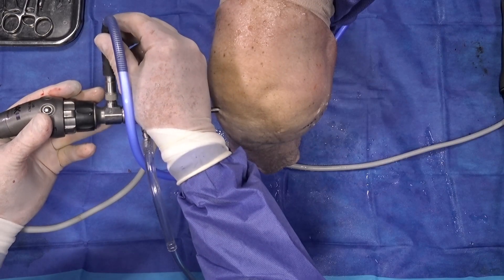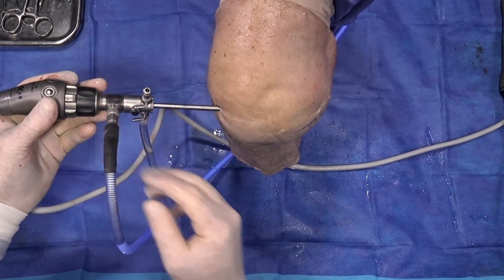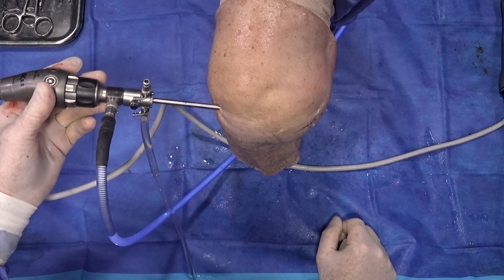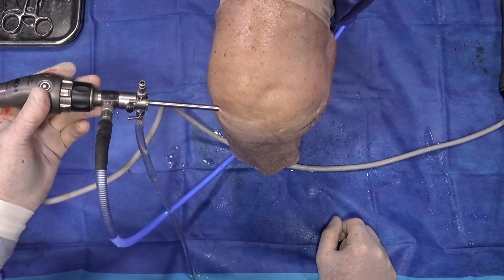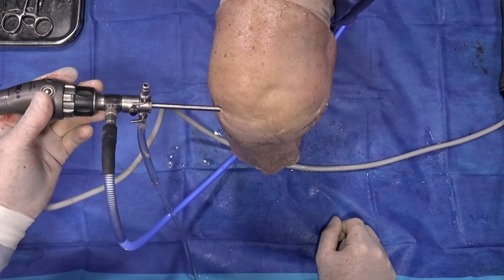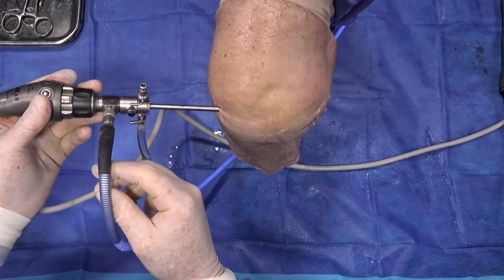The procedure starts with an initial diagnostic ultrasound of the knee confirming extrusion and instability of the meniscus — both the degree of extrusion and the reducibility — followed by a diagnostic arthroscopy in which intra-articular pathology of the knee is addressed. Once that's been adequately addressed, we then take the steps necessary to stabilize the meniscus and repair the medial meniscotibial ligaments.